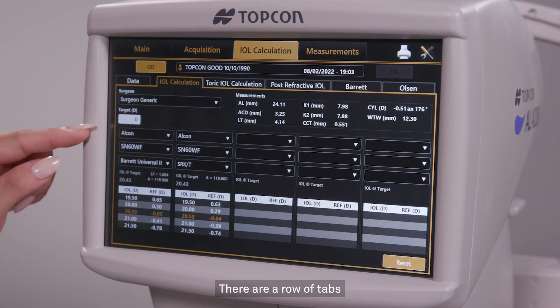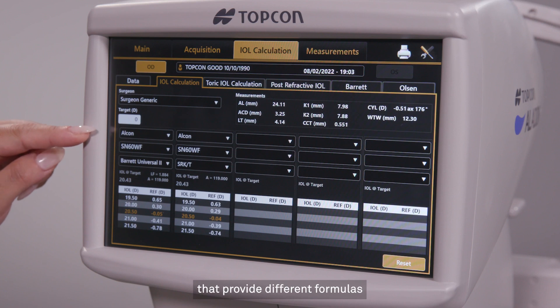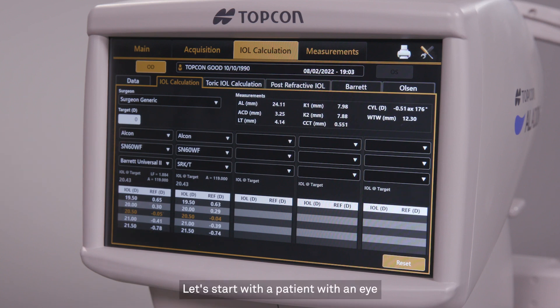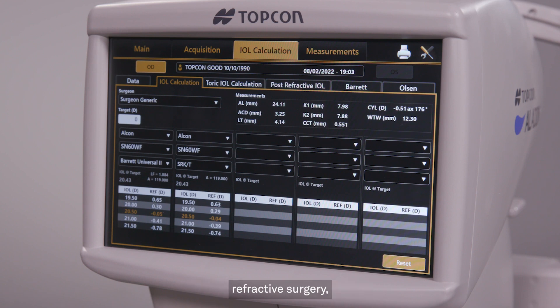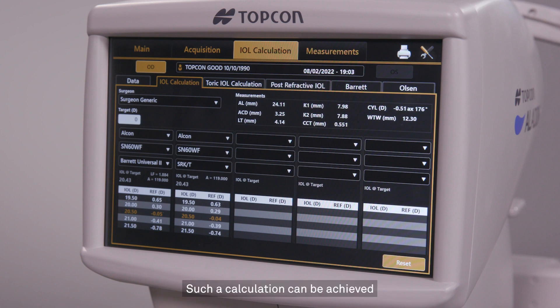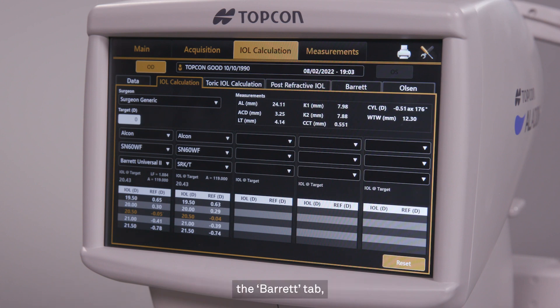There are a row of tabs that provide different formulas for different needs. Let's start with a patient with an eye that has not previously undergone refractive surgery and who needs only a basic intraocular lens. Such a calculation can be achieved with the IOL calculation tab, the Barrett tab, and the Olsen tab.